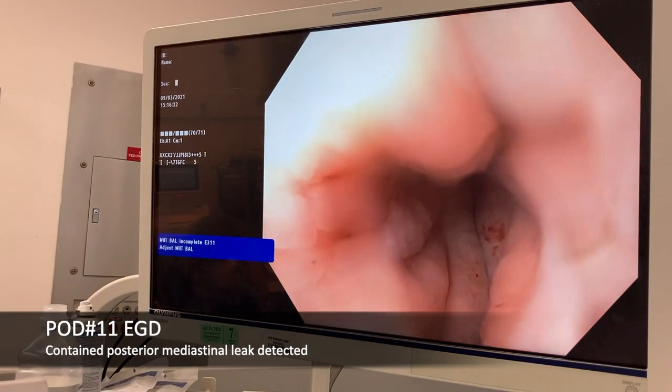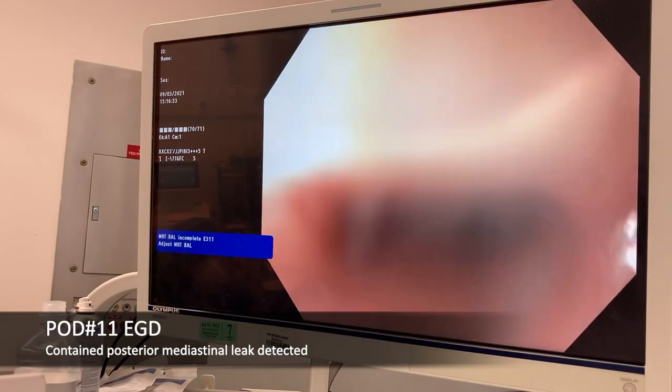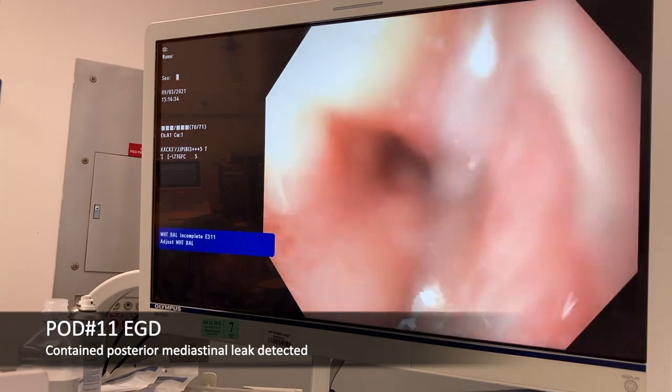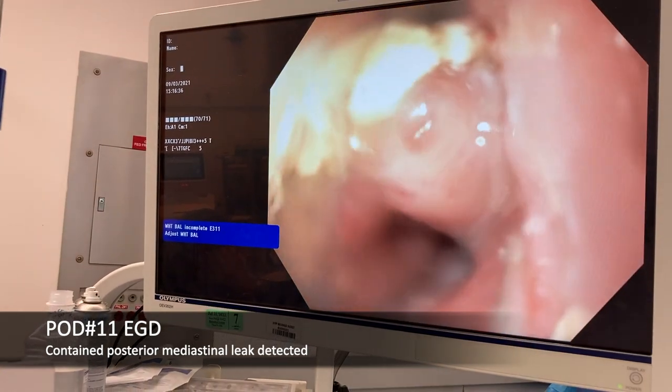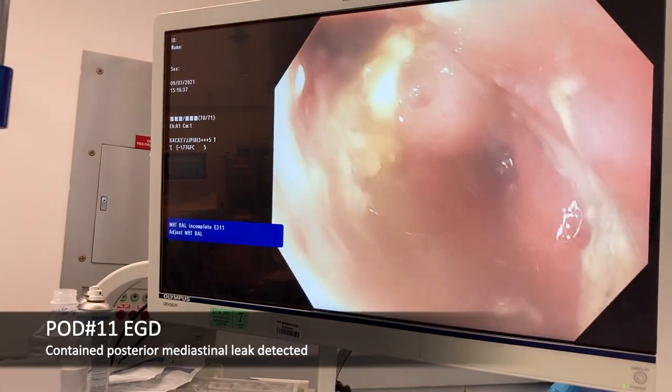Here is the admission EGD, showing a healthy gastric conduit distal to the anastomosis with a contained leak cavity.